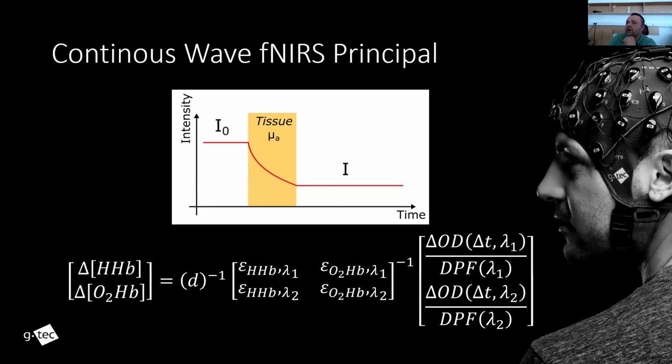Many continuous wave fNIRS commercial systems use estimations of photon path length derived from computerized Monte Carlo simulation and physical models to approximate absolute quantification of hemoglobin concentrations. Due to their simplicity and cost effectiveness, continuous wave fNIRS is by far the most common form of fNIRS, since it's the cheapest to make, applicable with more channels, and ensures a high temporal resolution.